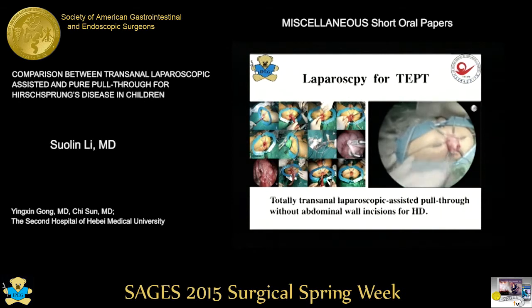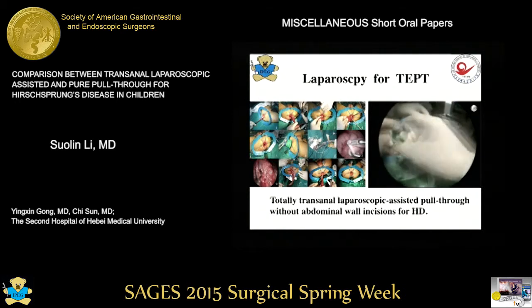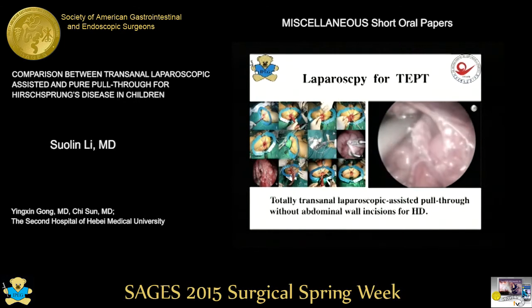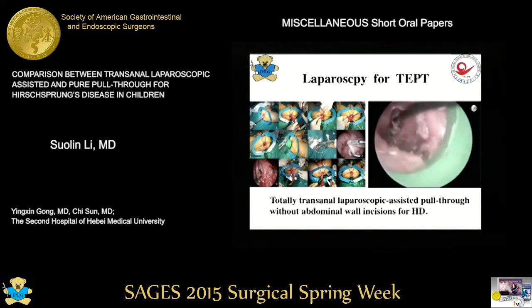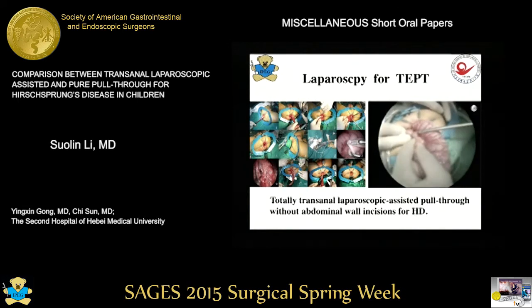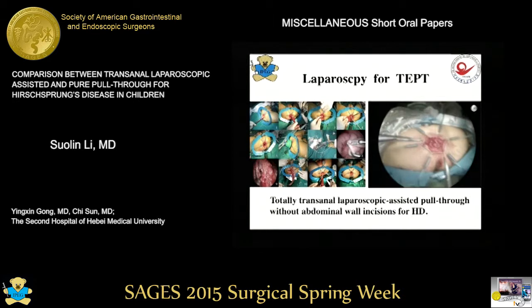The proximal rectum is closed and the rectum mucosa dissection is secured with ligation, avoiding fecal leakage and allowing for biopsy. A transanal multi-channel single port is placed and instruments are inserted. With direct transanal laparoscopic observation, the procedure of exploration and colon mobilization are much the same as classic laparoscopic pull through. Then the mobilized sigmoid is pulled and resected at the anus, and the anastomosis to the rectum mucosa is completed with absorbable suture.